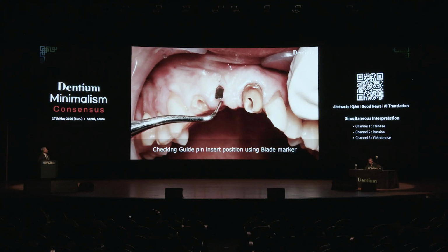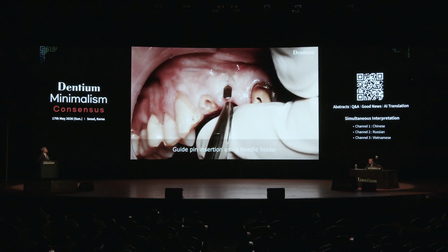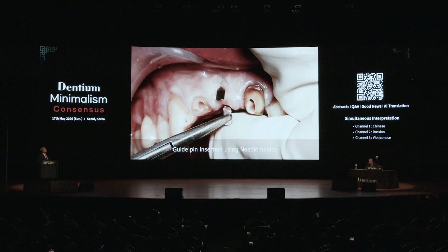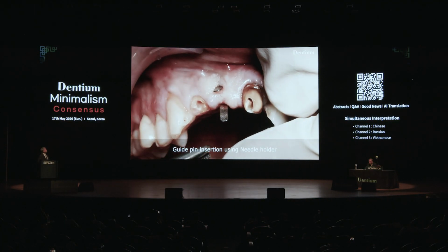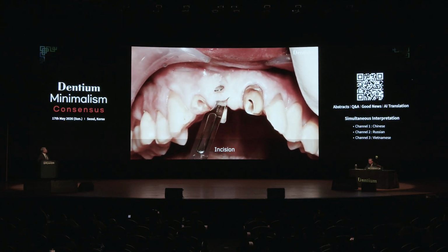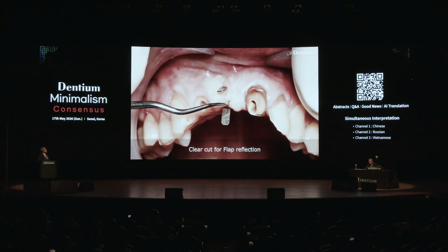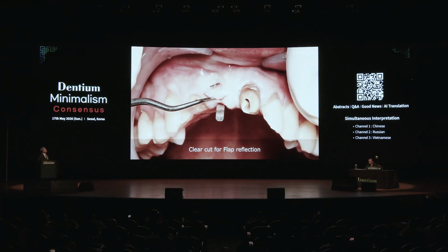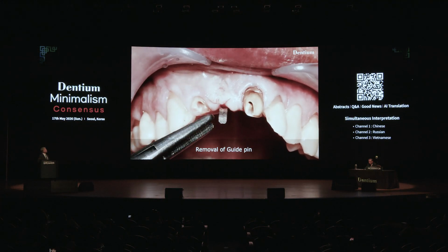There are two types: a full pin guide system and a simple pin guide system. The simple pin guide system uses disposable pins that can be carried by needle holders, and is also very easily handled. So at first we tried minimal incisions to check the buccolingual bone width. But the bone was too thin, so we extended the flap a little bit larger.